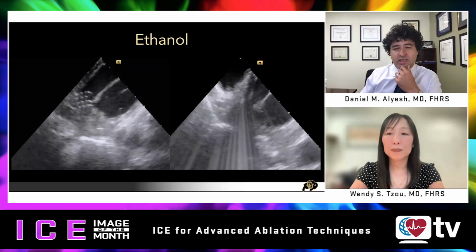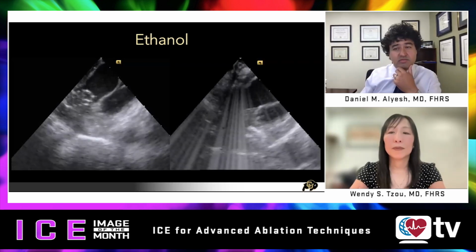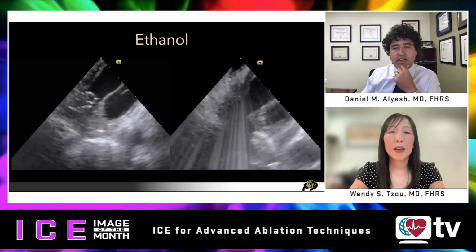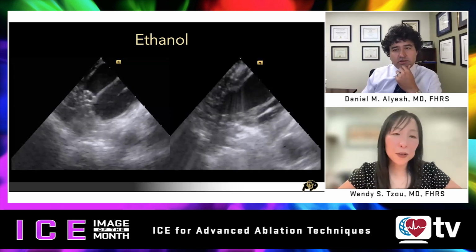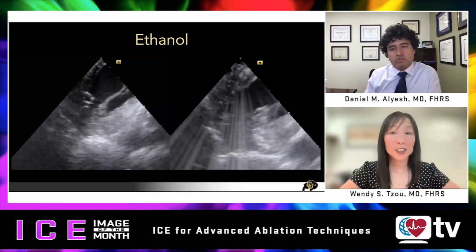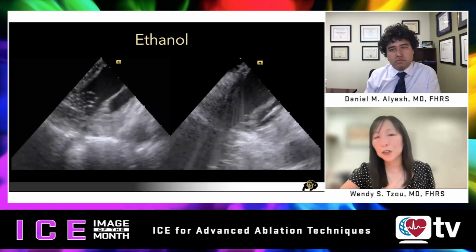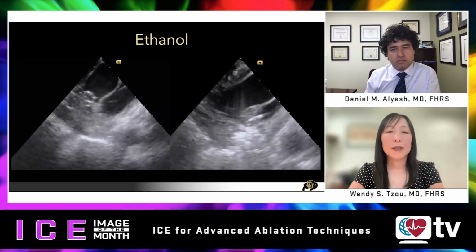Absolutely. I think monitoring for safety, monitoring for size, and dosing can all be helpful. I think too, if there's any worry about a perforation that could be clinically significant in a small branch like this, which is unusual because it's intramural, you can monitor for effusion at this time too.